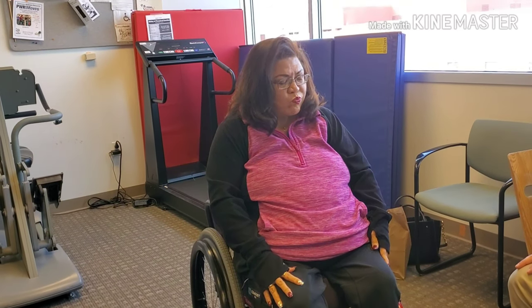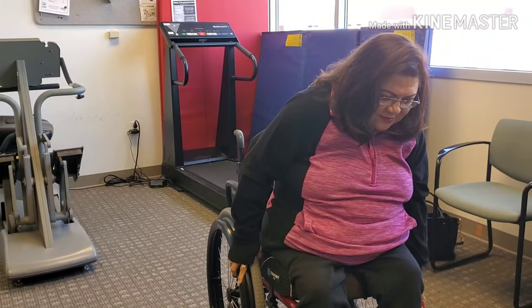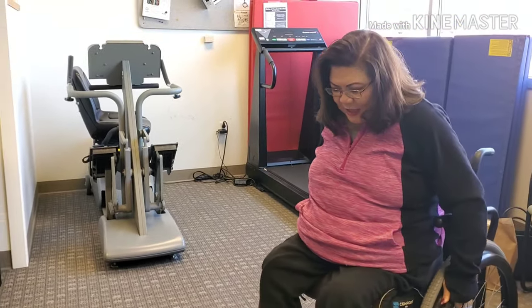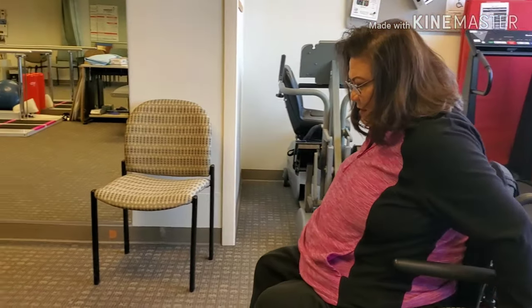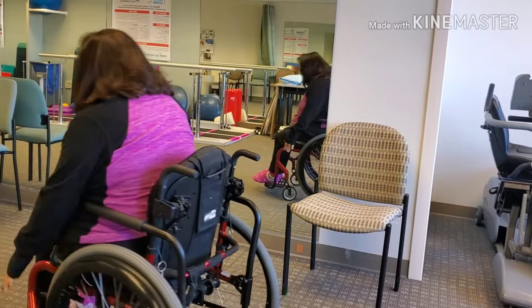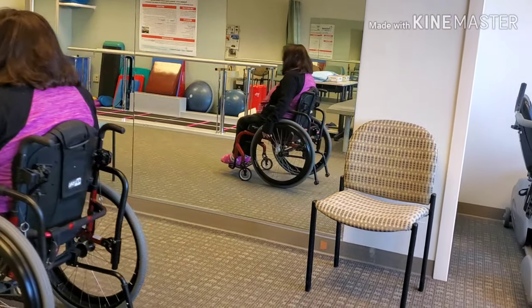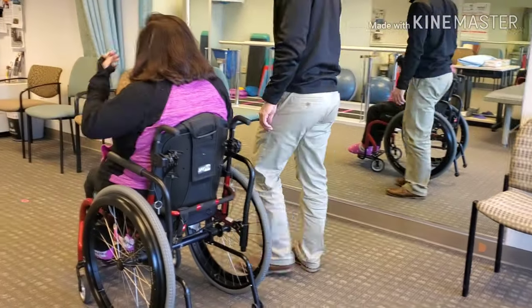Got your breath. I want to see how you push the wheelchair down there and back. Last time we talked about kind of push and then let it roll back. Push, and then your arms are going to do like an oval. Do you use your seatbelt ever? Sometimes people feel more comfortable if they have their seatbelt on, but it's up to you. Most people don't, but sometimes you'll feel more comfortable.